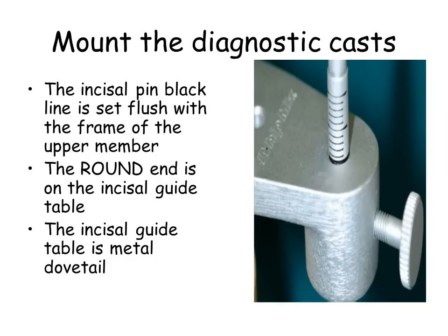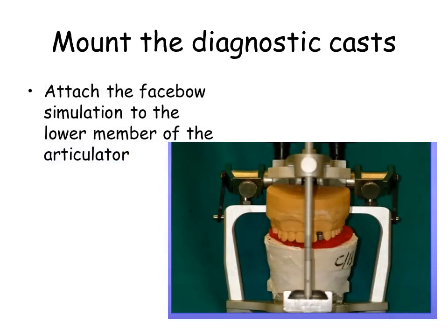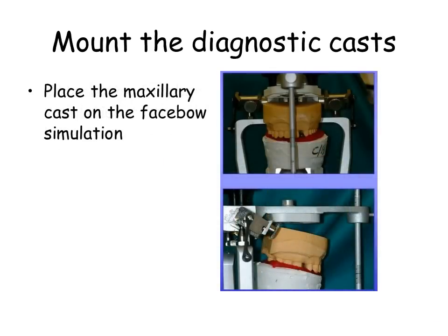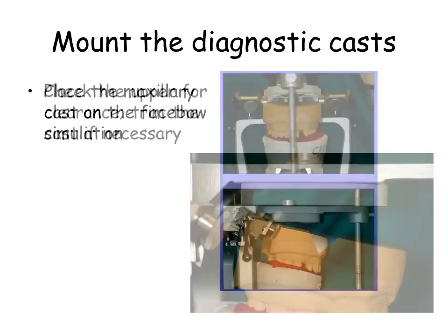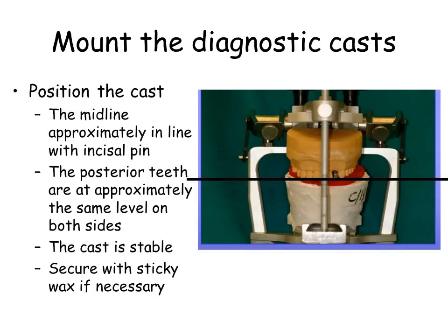Attach the facebow simulation to the lower member of the articulator. Place the maxillary cast on the facebow simulation. Check the upper for clearance; trim the cast if necessary. Position the cast with the midline approximately in line with the incisal pin. The posterior teeth are at approximately the same level on both sides. The cast is stable. Secure with sticky wax if necessary. Attach the maxillary cast with plaster. Apply lubrication only to index grooves.